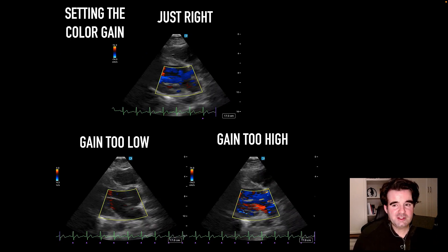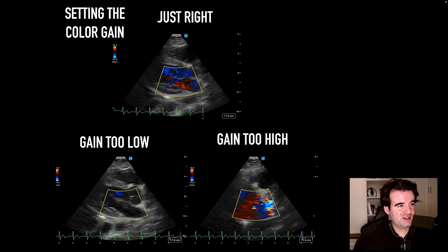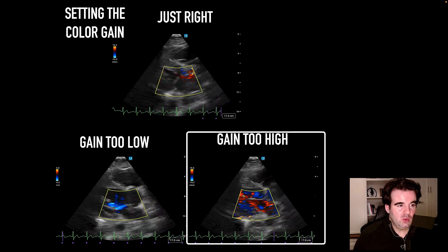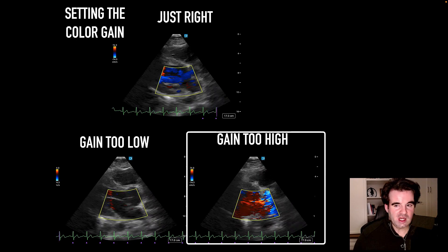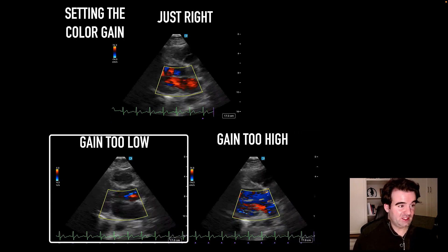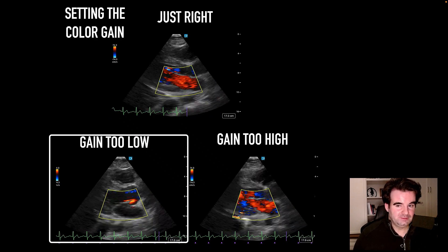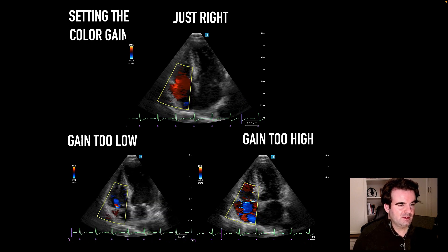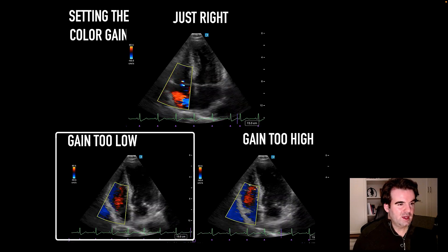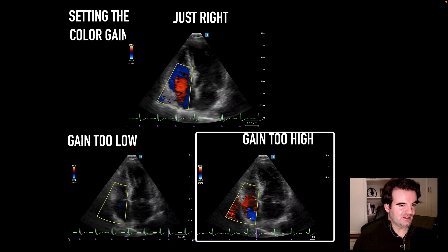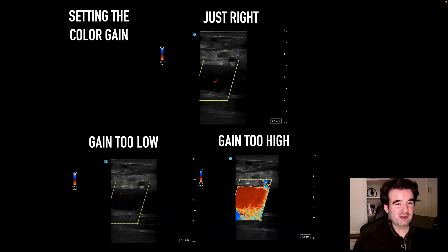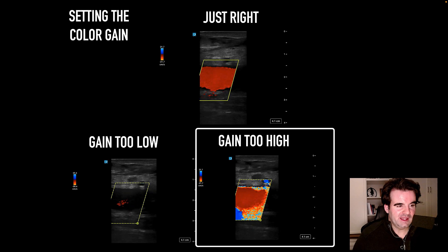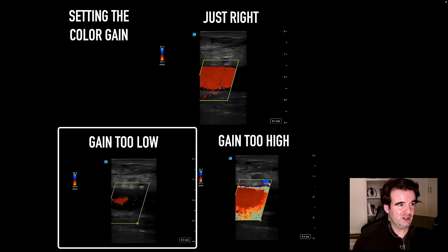Moving on to color gain — similar to 2D ultrasound, color gain can allow amplification of both signal and noise. The goal is to maximize signal, but with gain too high we can get what's called color confetti, which is a color equivalent of distortion. With gain too low, we see a signal that's relatively muted. This is shown in the apical four-chamber view with the tricuspid regurgitation jet. With gain too low, we minimize that signal; with gain too high, we have trouble separating signal and noise. These principles apply equally to vascular ultrasound — set the gain too high and you get confetti with color spilling outside the vascular walls; set it too low and you barely get a signal.